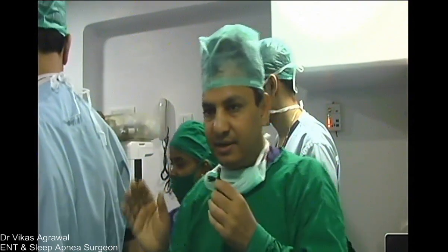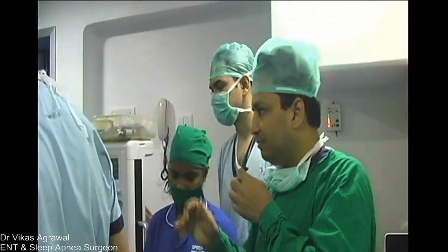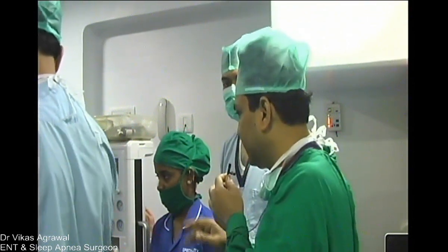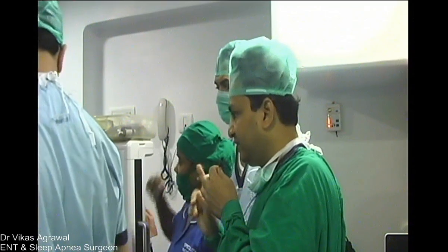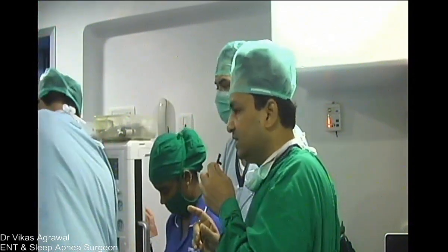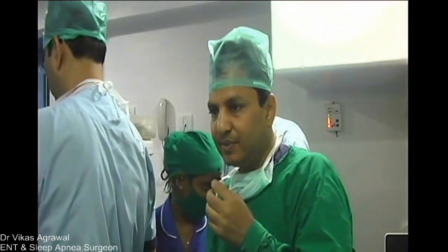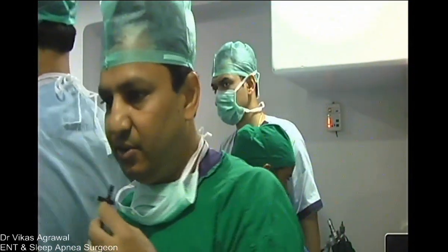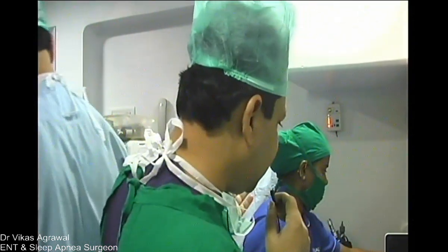So we know that this is a difficult airway situation, but I am very sure that Kalpesh will be able to do it nicely. He is keeping the endotracheal tube, LMA, everything ready, and now is inducing the patient. At an appropriate point of time, we'll show you the intubation. Meanwhile, Rahul, do you have any other question in mind?